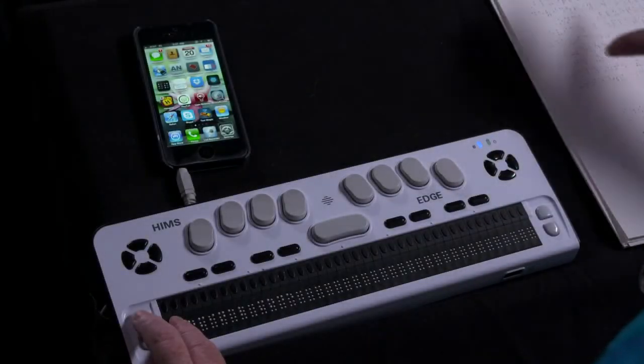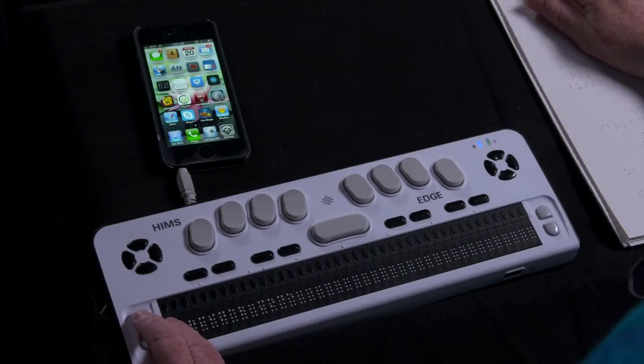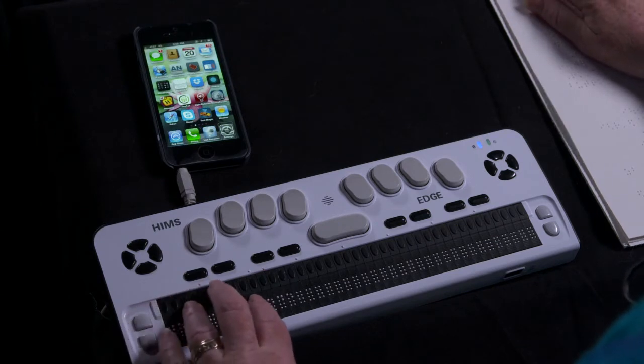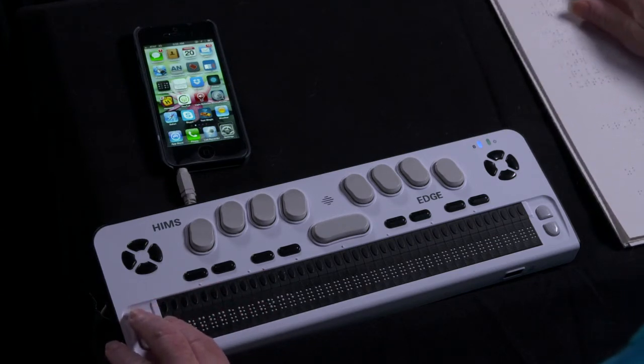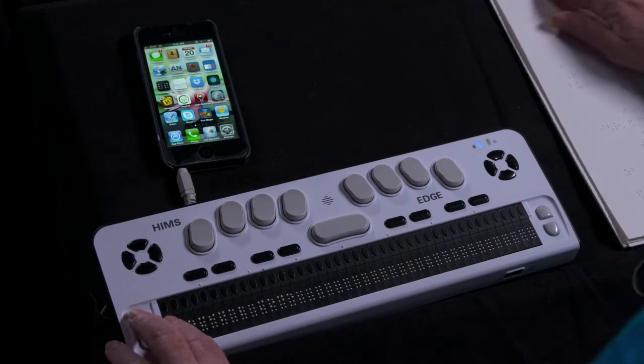To pair a Braille display, make sure the Braille display is turned on and discoverable. I'm going to demonstrate this process by pairing a Braille Edge from HIMS with an iPhone.